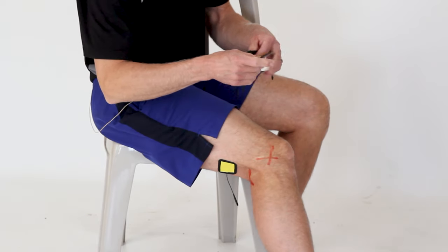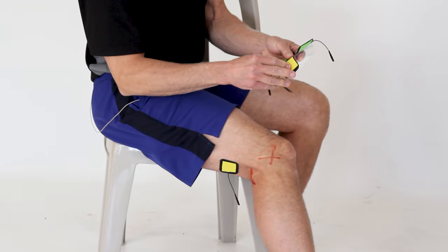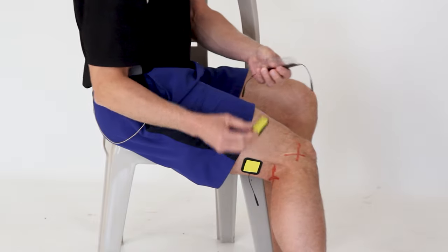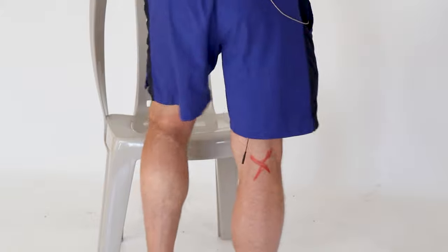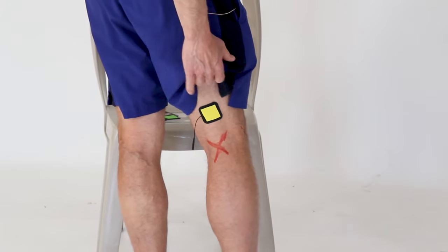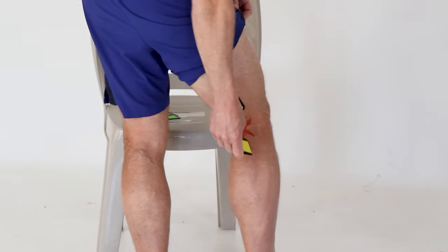Can we change the channel too? Yep. We'll go to channel one, two I mean. Now channel one. Yep. So we got colors. The number's not that important, but we know that the yellow goes with the yellow. Normally the pads do not have colors on them. The pads are going to be black. But we're doing this just to help you know when we're using channel one and channel two.